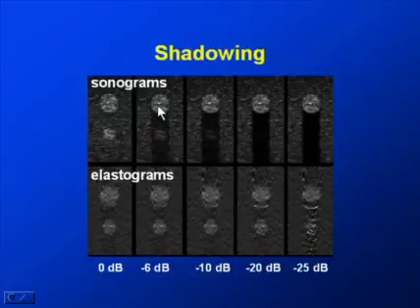But see how the lesions that are here, the echogenic nodules, you can see in the first image that there is a lesion up here. You can see it very nicely in elastography.